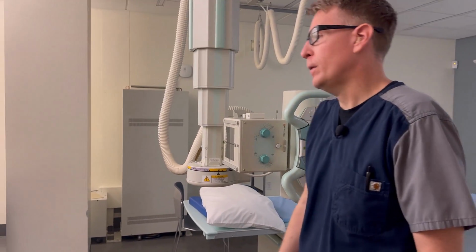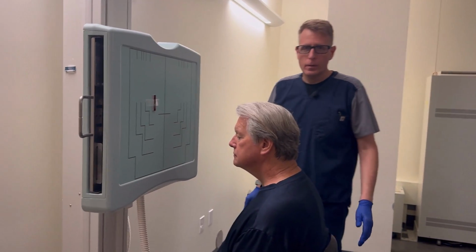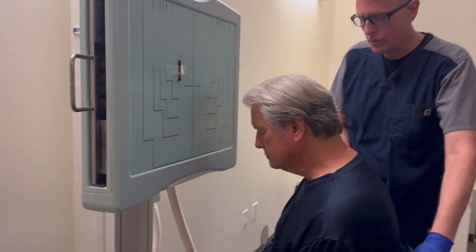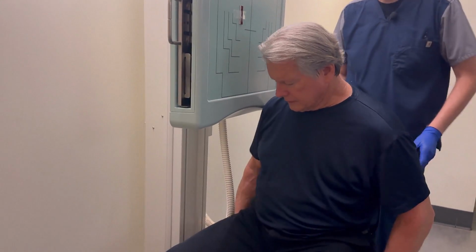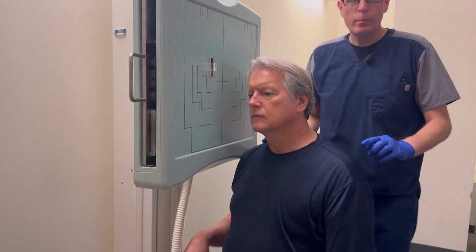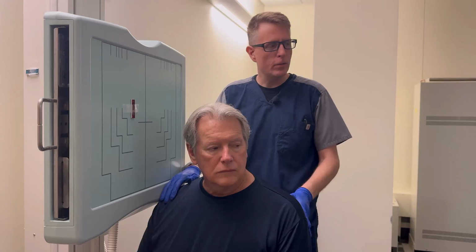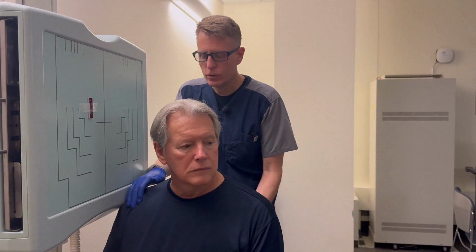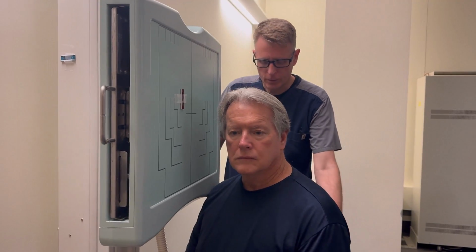So I'll show you what I'm going to be looking for when I'm framing my collimation. We're going to start by having our patient get close to the board for a lateral projection here. So we'll start with your patient sideways, right side close to the bucky for this right lateral. And I want my patient to turn his head toward the camera, toward the x-ray tube, as much as you can. And then we'll spin the shoulders, just rotating the chair to get you in a little closer.